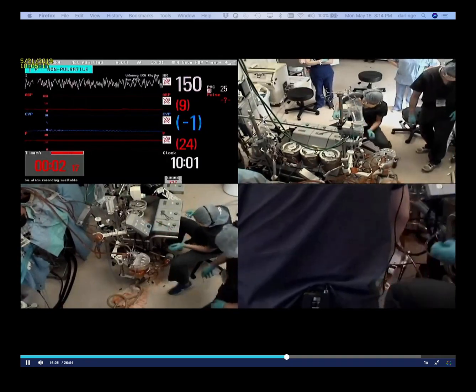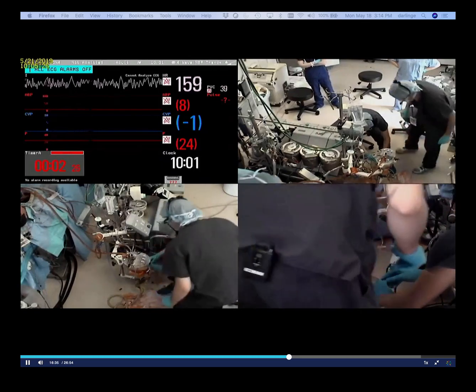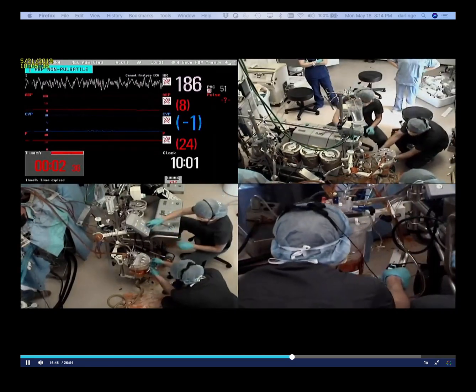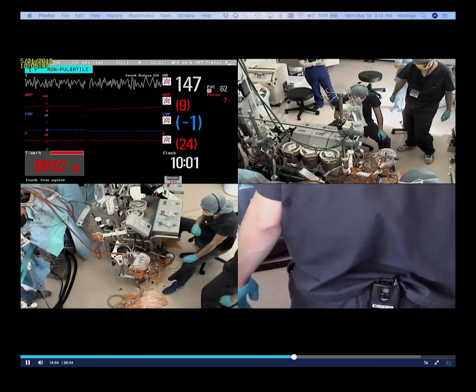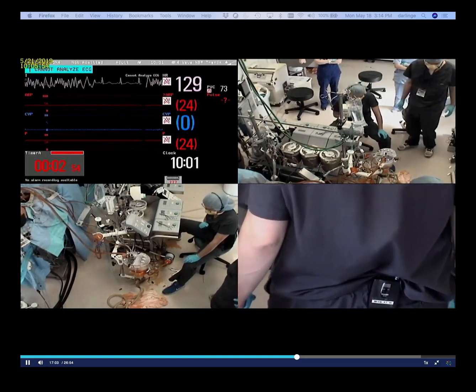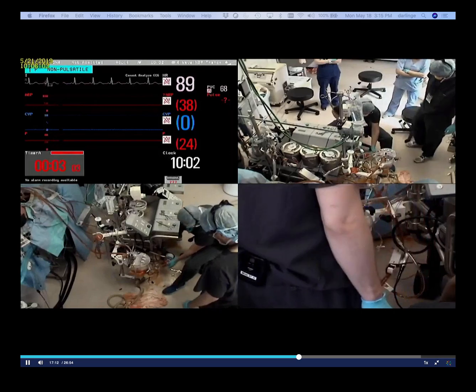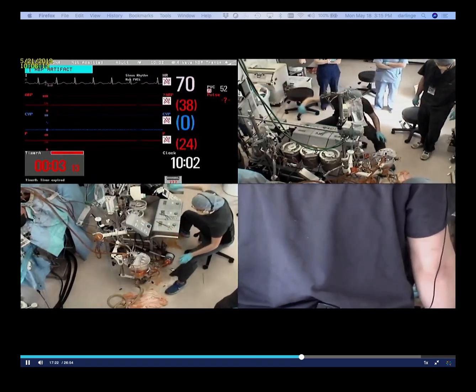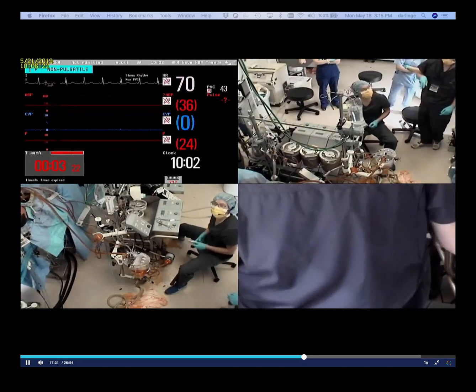It's not too late — fix it. You can purge it out through that little pigtail at the top. Open it up and get rid of that air. The air is in my cardioplegia line — it's not going up the arterial line, only through to the cardioplegia system, which I turned off. I'm coming back up on flow. Working on the pressure — are you ready to come off bypass? I think so. We can start ventilating the patient.